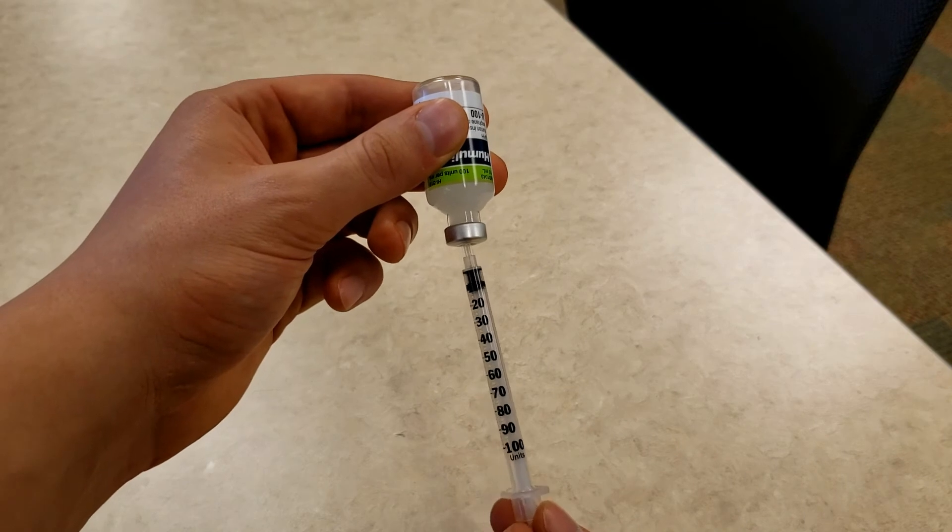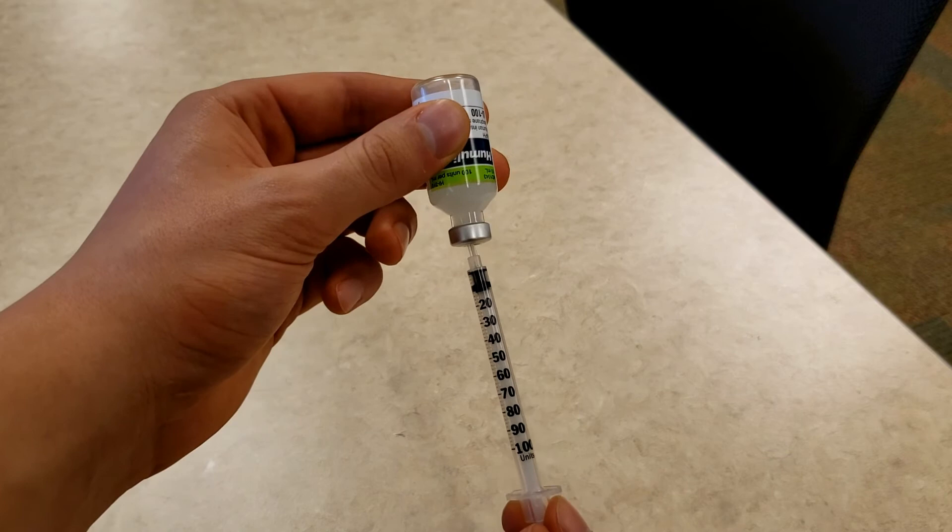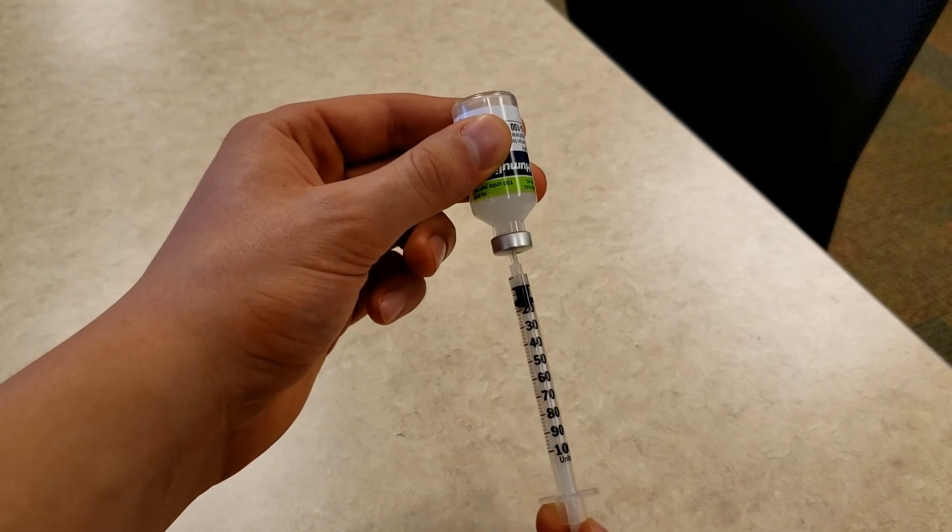Now you can pull the plunger down to your exact dose of insulin — in my case that is 14 units. Then you can remove the needle.